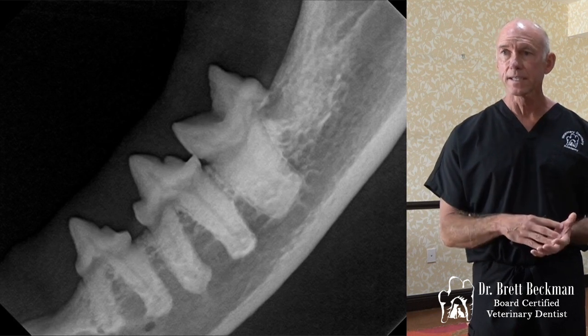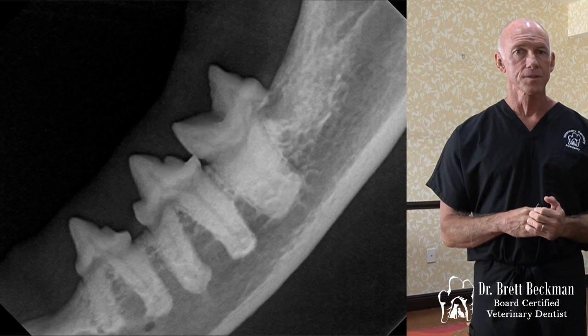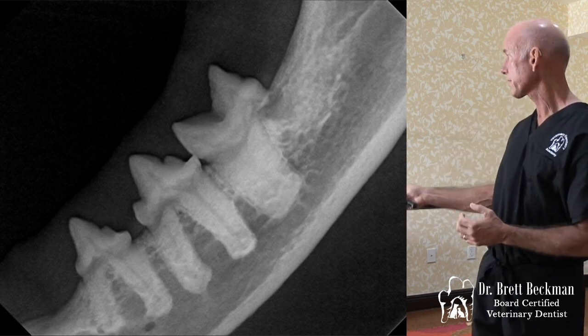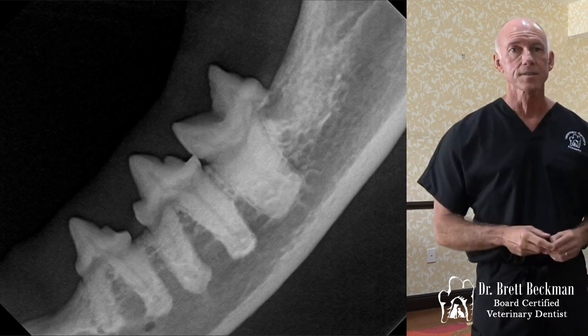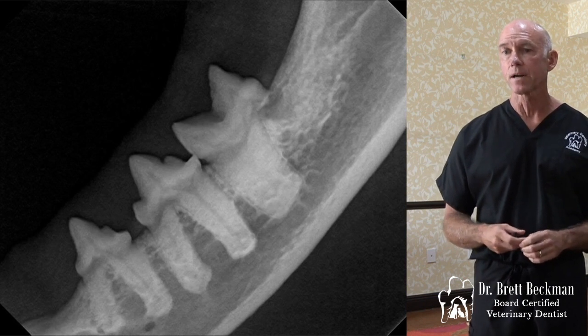You've got granulation tissue in that, but the long and the short of it is you don't leave that. You extract the tooth, and in doing so, with your flap open, you've got access to clean that out, suture it back, and you're good to go.